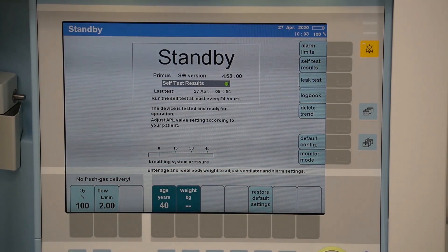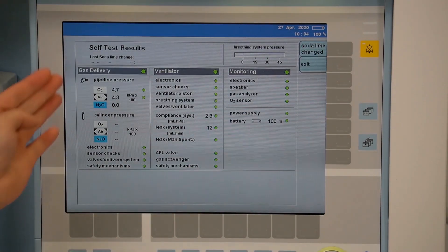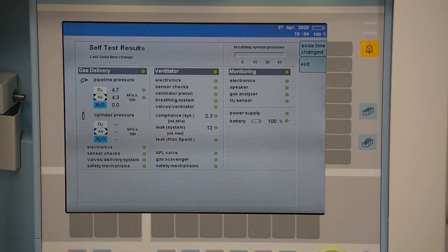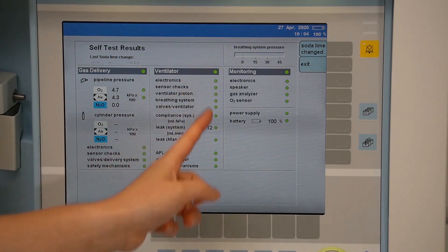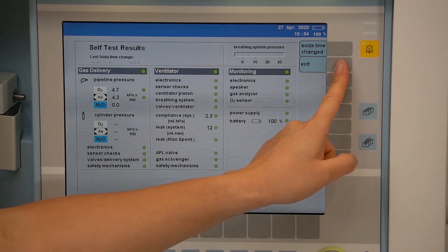Red would indicate a serious fault has been detected — do not use the device and please contact your biomedical engineers. To bring up the details of the self-test results, simply select this option and all the steps of the test are displayed here with the color indication of the result.